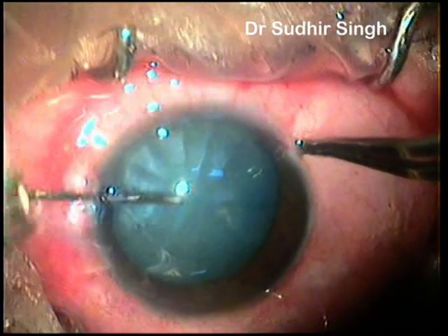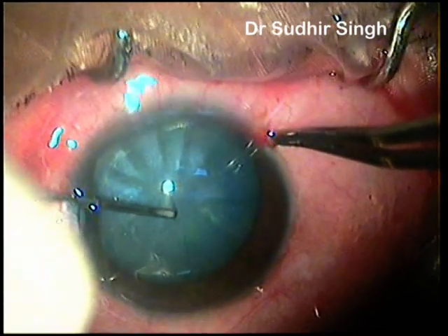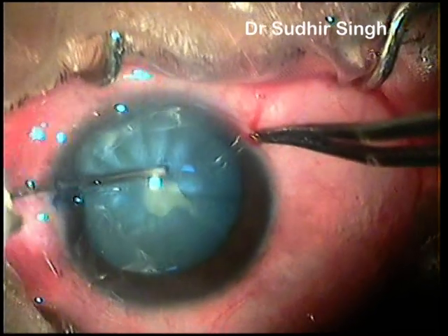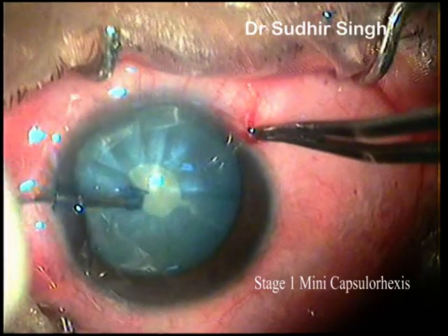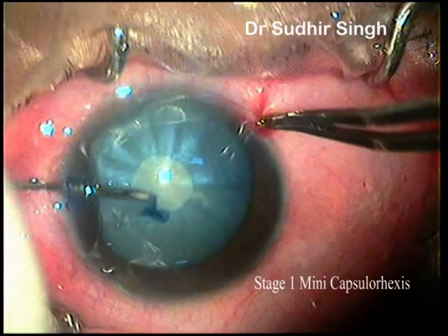The anterior capsule is stained with trypan blue dye. The anterior chamber is filled preferably with cohesive viscoelastics — sodium hyaluronate 1.4% was used in this case. A three-stage capsular rhexis is attempted. Stage 1: a mini capsular rhexis of about 2 mm is made by needle cystatome introduced through the side port.